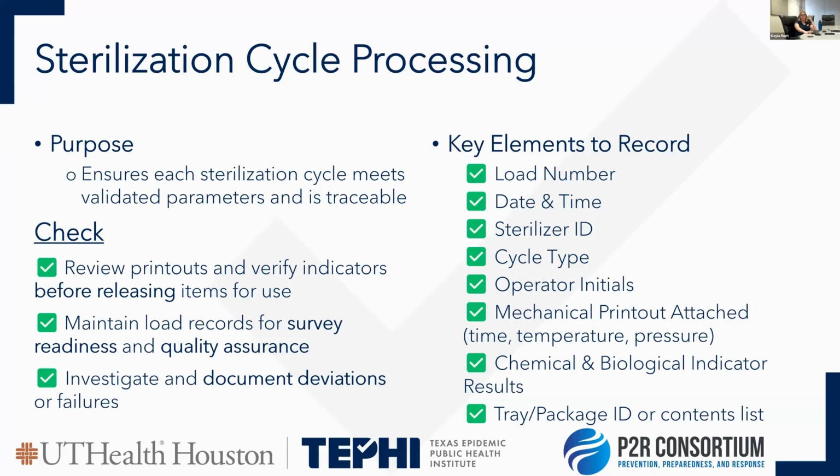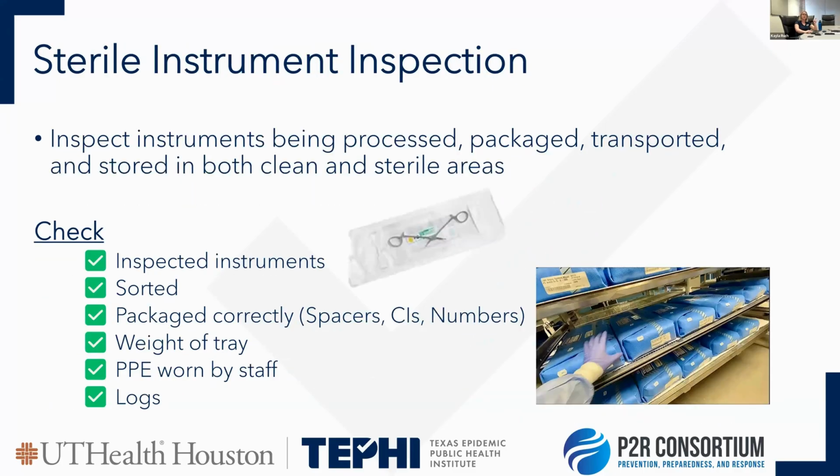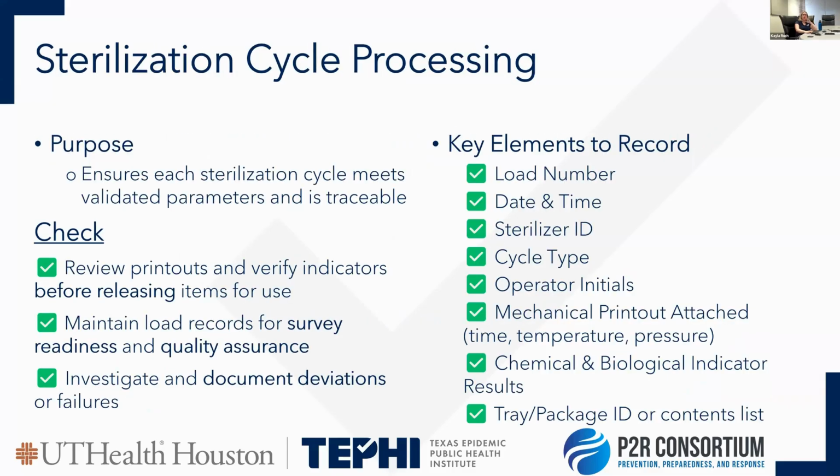You want to make sure that you know everything is numbered, that if you're having multiple sterilization cycles, that they're numbered accordingly, and whatever mnemonic or numbering scheme that you do at your organization, if it's day, time, if it's a specific number, if it's a color, however you want to do it, as long as that you can speak to your process, especially when it comes to audit or when you're doing an investigation for an outbreak situation, or a follow-up of surgical site infections, you have a way that you can trace back the pieces of equipment as well.